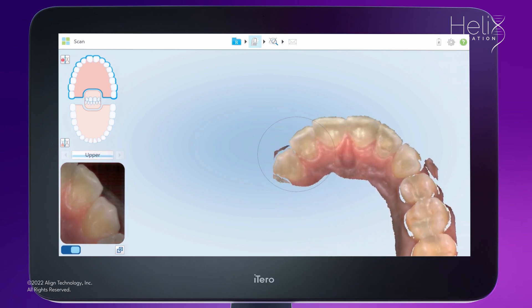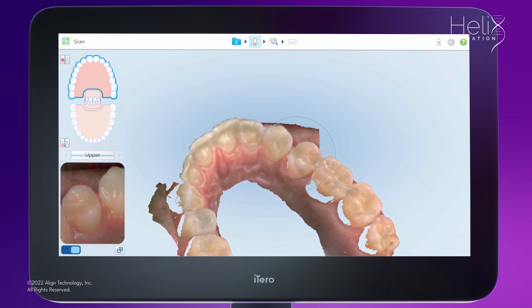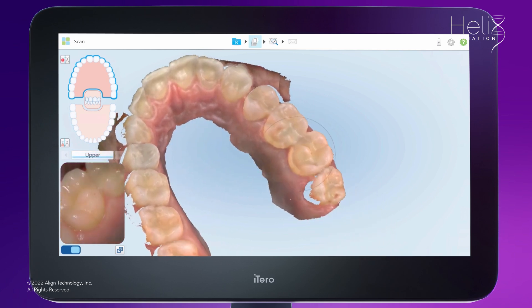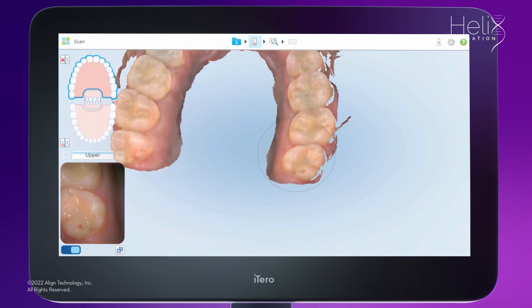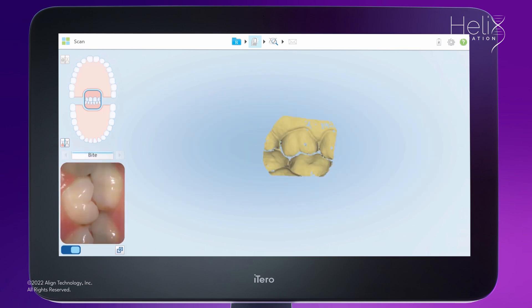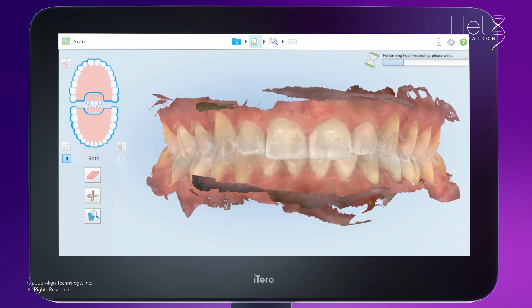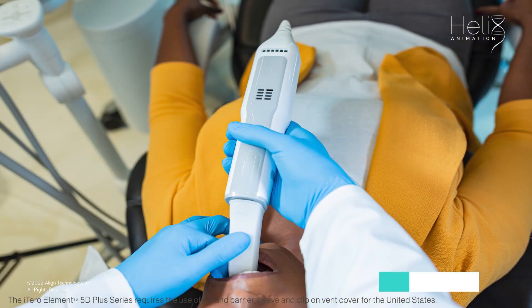Remember that the teeth are in contact and both arches are moving as a product of the Invisalign Clear Alignment Therapy. It is also important to scan both arches to enable the user to keep track of changes using the iTero time-lapse technology. Before starting the scan, confirm that the teeth are free of excess saliva.